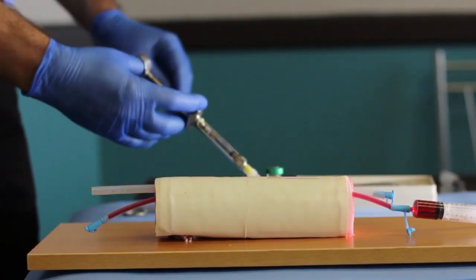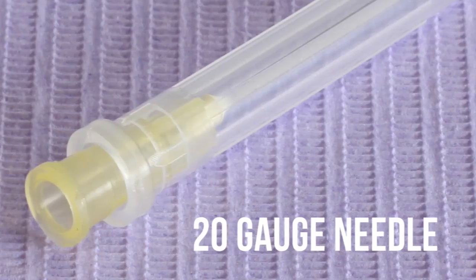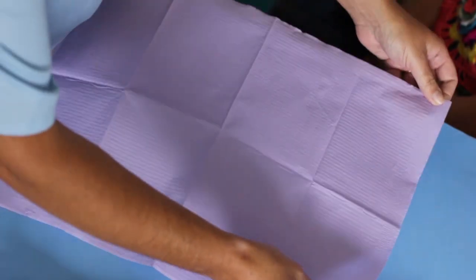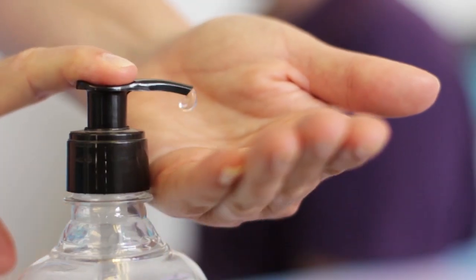You will need the venipuncture trainer, a pair of clean gloves, a 5-milliliter syringe, a 20-gauge needle, a clean work surface cover, the IV fluid bag, and alcohol hand rub.